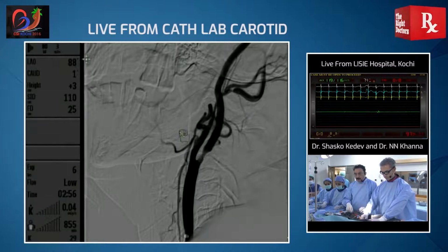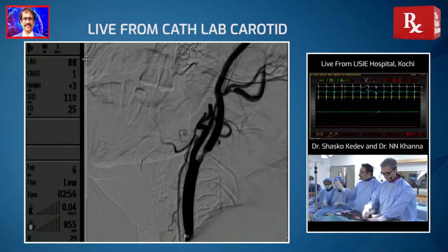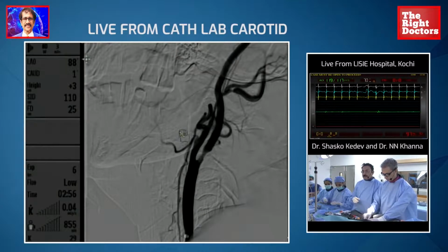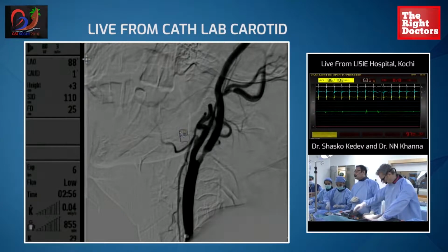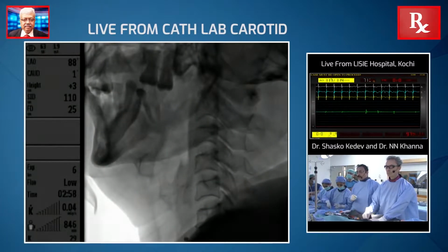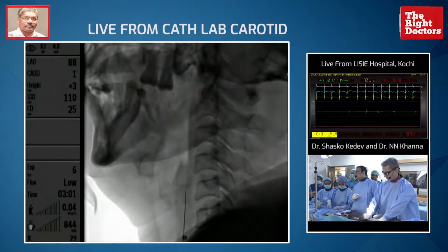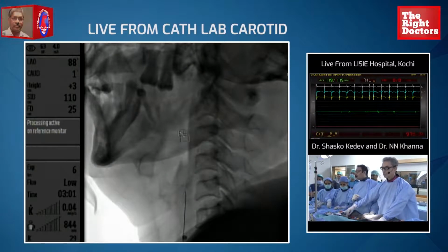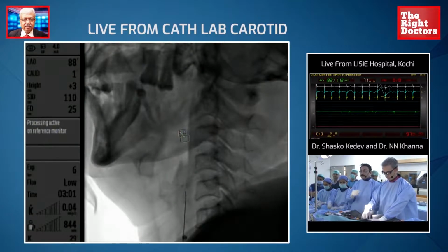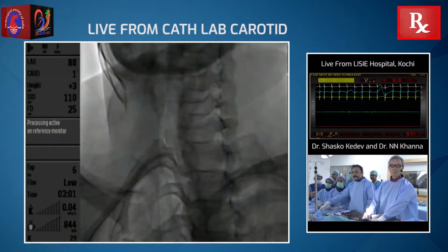So I will run the angiogram so you can have a look. Can we have the first angiogram? Okay, can you see the fluoro? Okay, so we'll just show them the first angio.